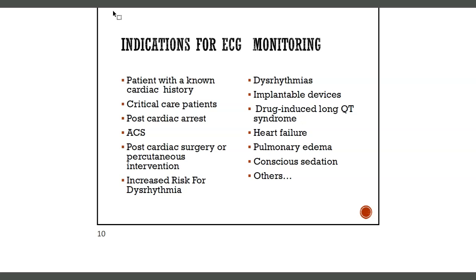If it is known to prolong QT, before we can even give it, we need to make sure that they're on a cardiac monitor. In addition, patients with heart failure, pulmonary edema, and then if somebody is under conscious sedation. There are many other indications for EKG monitoring, but these are some of the common reasons why we need to monitor our patients continuously on an EKG.